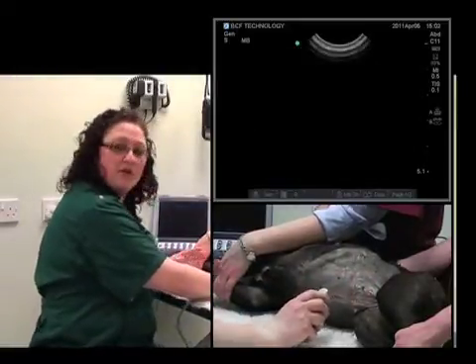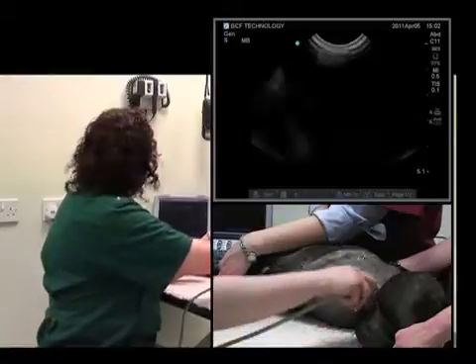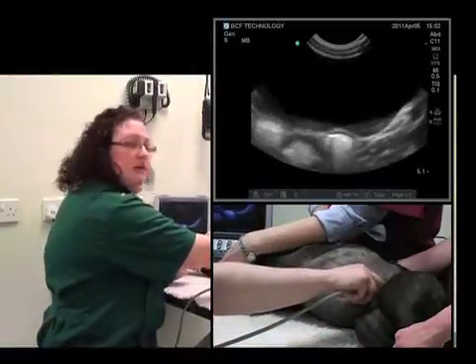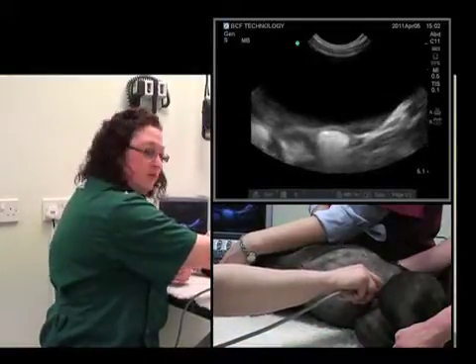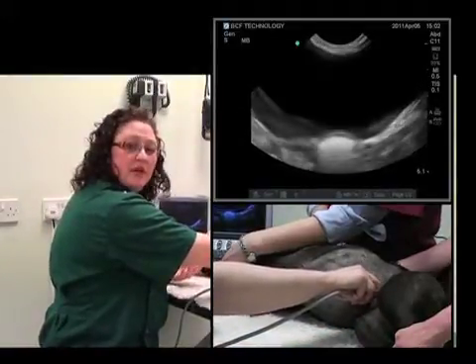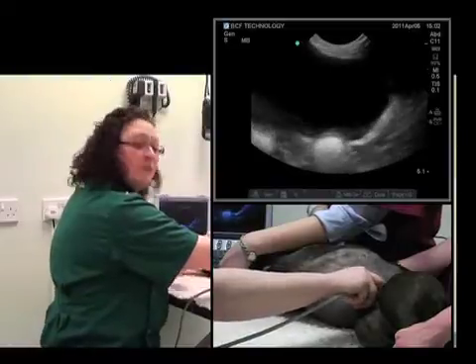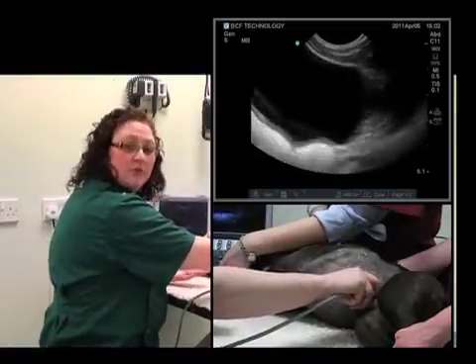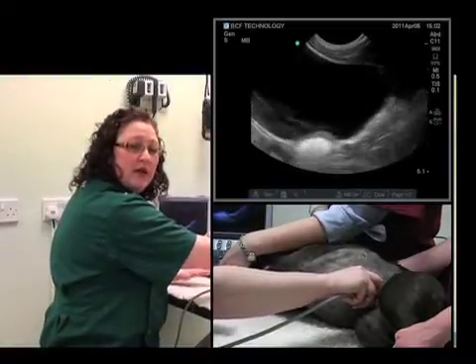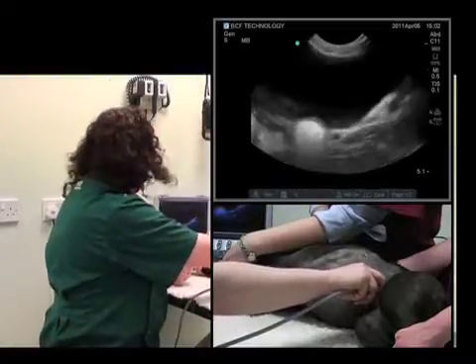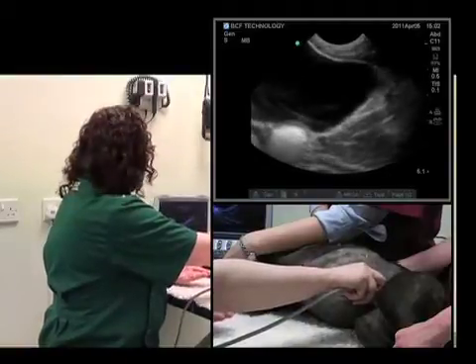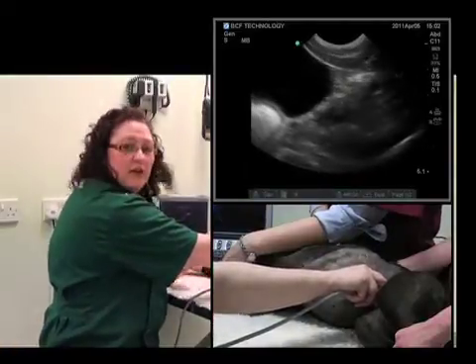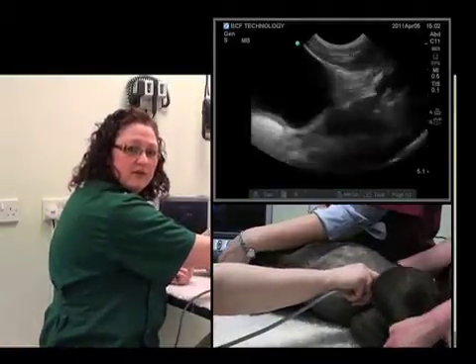What you can also do while in this area is if you are worried about there being a pyometra, a stump pyometra, or looking at the prostate of a male dog, you can actually proceed a bit further caudally and evaluate those organs as well.